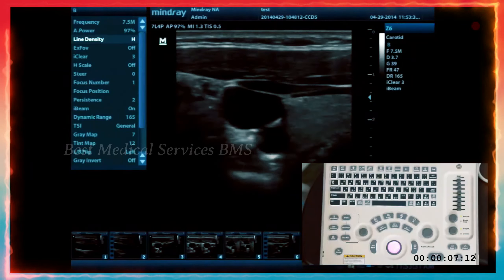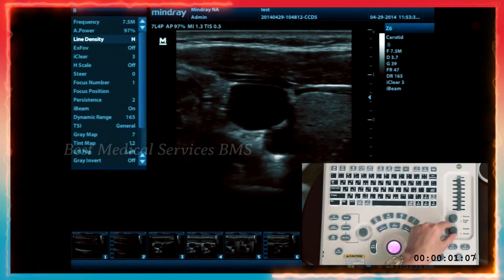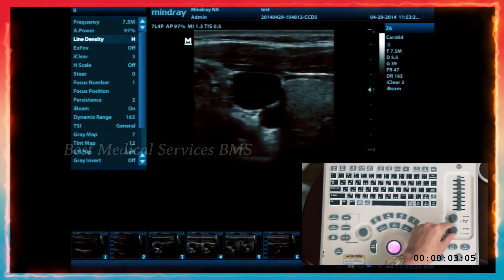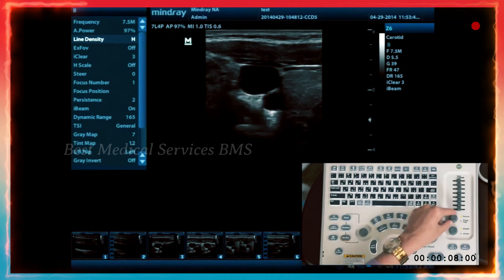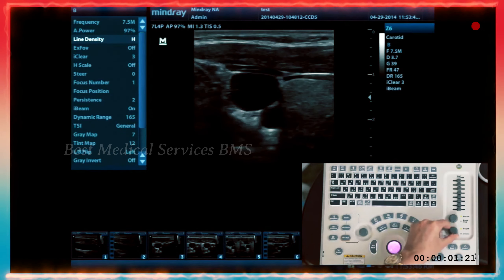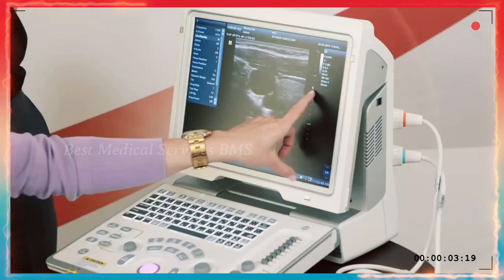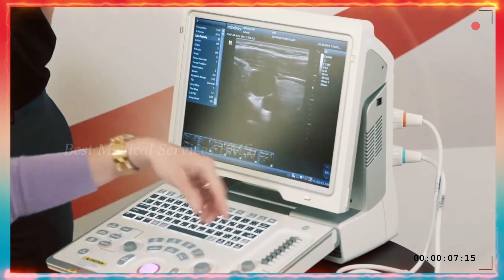As you're imaging and need to change your depth — say the carotid is a little deeper — turn that knob to get more depth. Right above the depth knob, focus is what you'll often want to change when you change depth, to make sure the image is crisp and clear. You want your focal zone parallel and inline with what you're looking at.